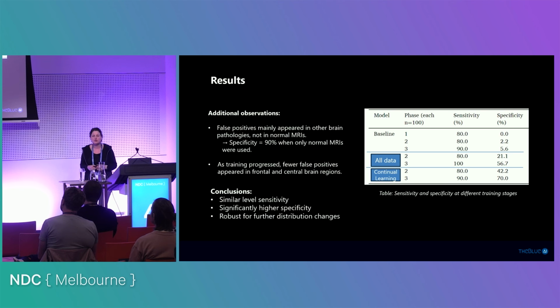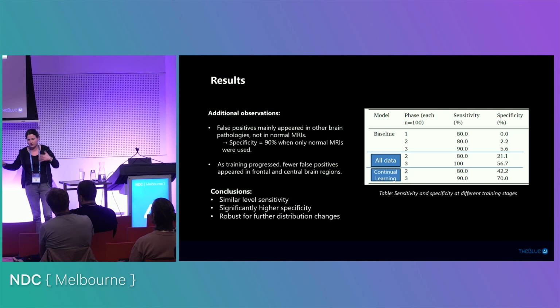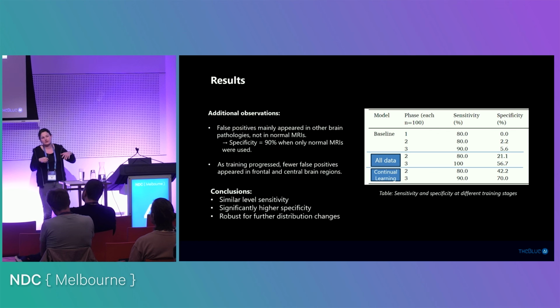I mean, if you think about it, if you continued with a distribution that mimics real life, meaning there would be just 1% of FCDs, at some point the model will just say, hey, I'll just optimize my function, I will always say there's no FCD, and I'll achieve 99% accuracy, because this 1% is not so relevant. But the super interesting thing with continual learning here is that we have trained the model in the first stage to recognize the FCDs and where they are very well, and then we're still keeping this knowledge.